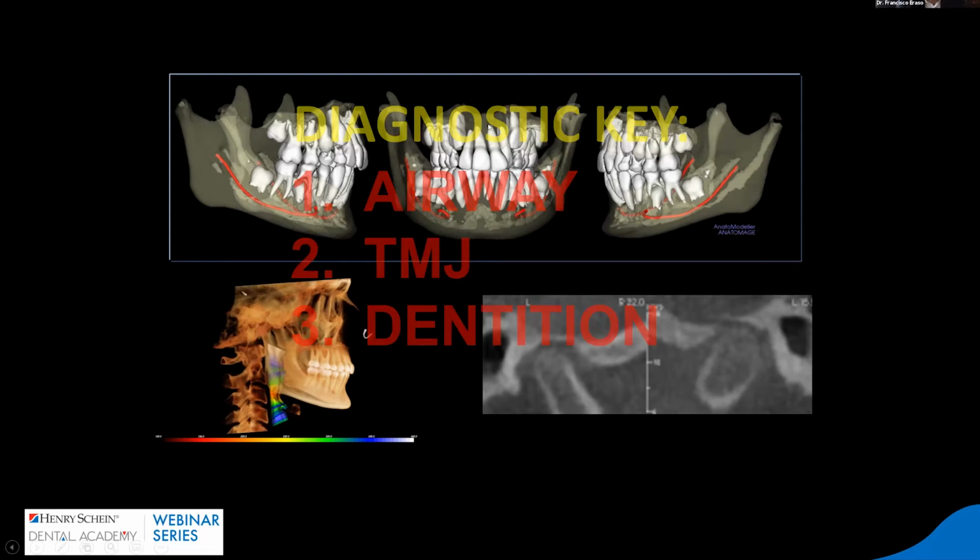So we need to know if we have bone to move teeth, and if we're going to do expansion, what is the effect on the surrounding cortical outline. And today we have technology, and we're introducing technology to use CBCT in our aligners, for example.